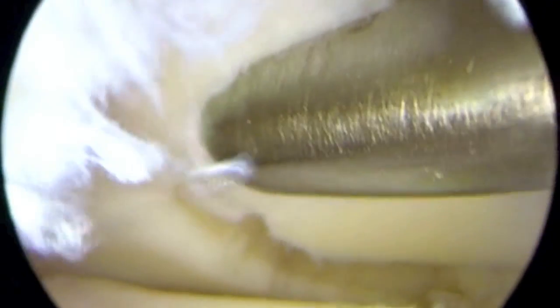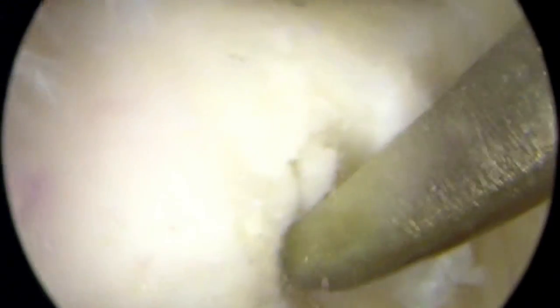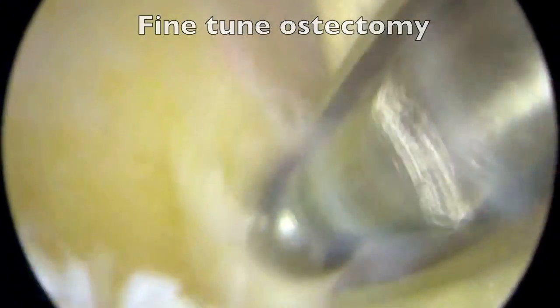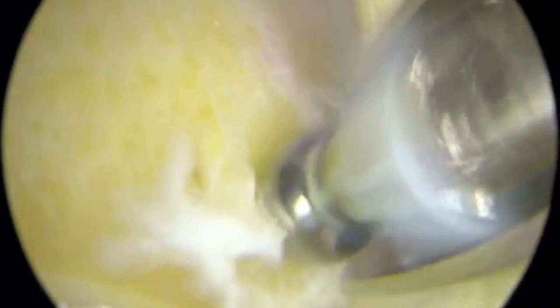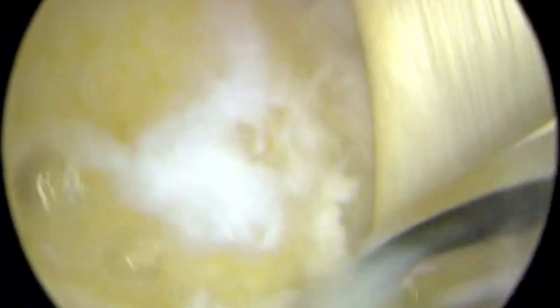Finally, a burr or rotating device is used to fine-tune or smooth out the rough edges of bone that remain. The big toe can be moved to assess whether the tendon attached to it, the FHL tendon, has been appropriately released, or if anything else remains that may cause it to snap or catch.